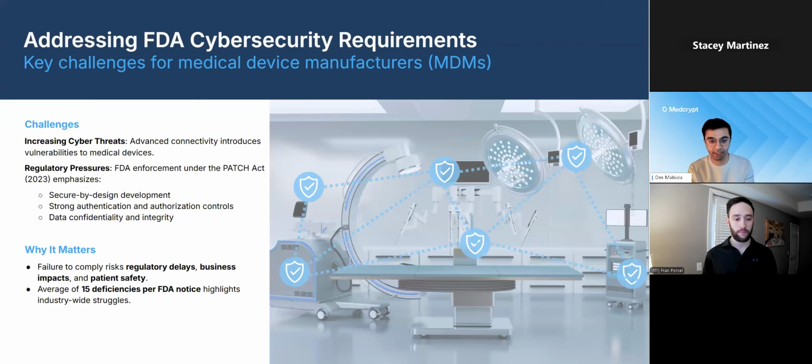And so it's really important, like Fran's been echoing a lot, to think about cybersecurity from the design and development phase of your medical device, because the last thing you want to do, as you're getting close to submission to a regulatory agency or go to market, is have to add on a bunch of new work and potentially redesign aspects of your system.